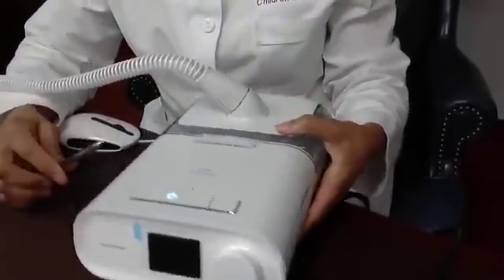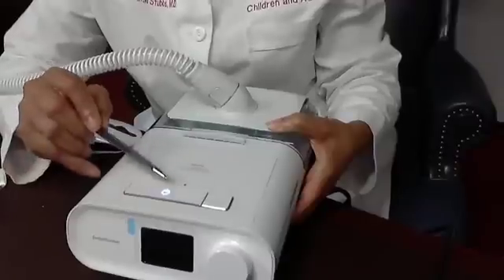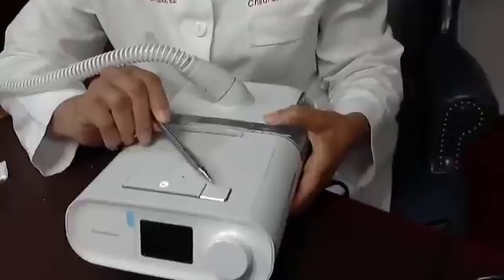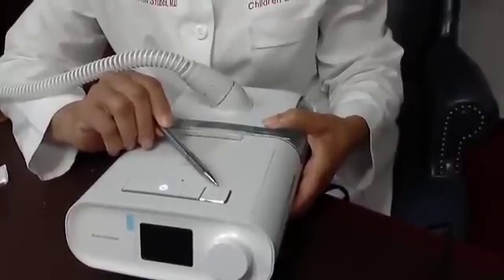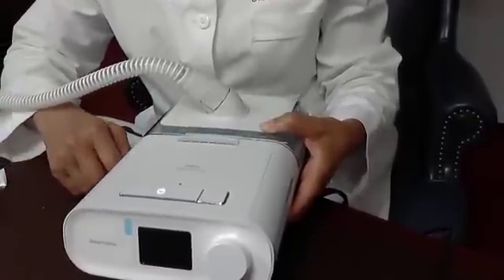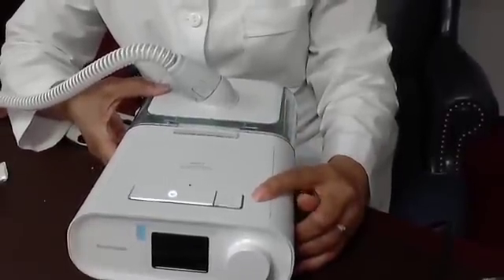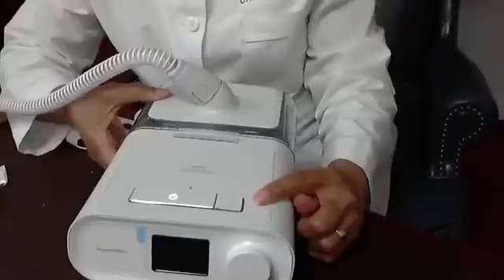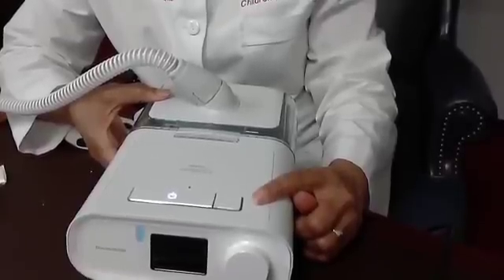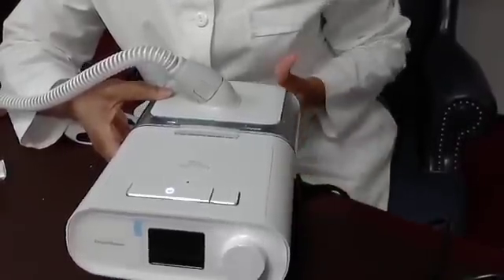When you get your DreamStation, you have the on button — this is also how you turn it off. Next to it is your ramp; this is a triangle. The ramp is a comfort feature. It allows the machine to start at a lower pressure than what's needed to open up your airway. If you need a high pressure, this will let you fall asleep at a lower pressure while the machine gradually increases until it reaches the required pressure. It allows you to fall asleep easier.